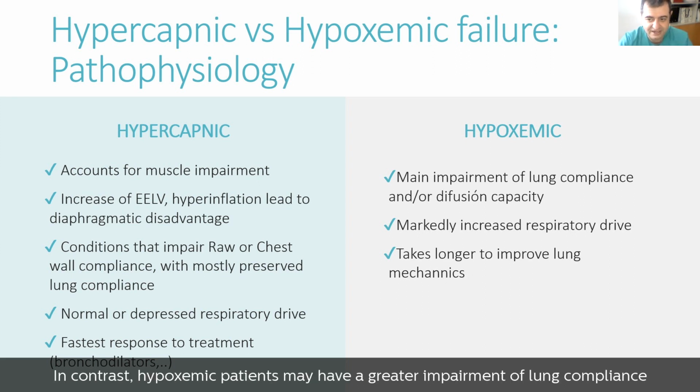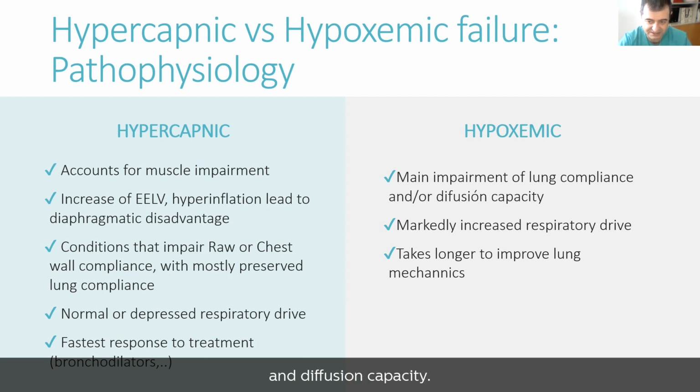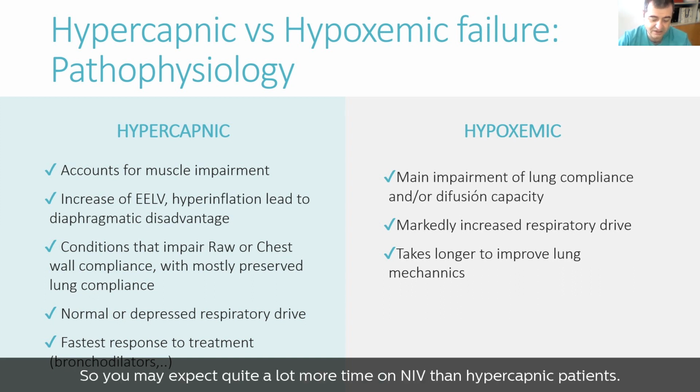In contrast, hypoxemic patients may have a greater impairment of lung compliance and diffusion capacity. So they have a markedly increased respiratory drive, and these conditions will take longer to improve lung mechanics. So you may expect quite a lot more time on NIV than in hypercapnic patients.